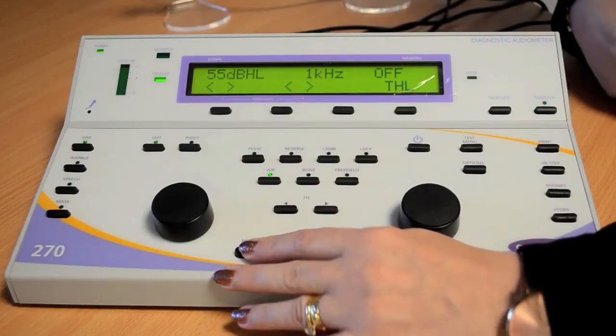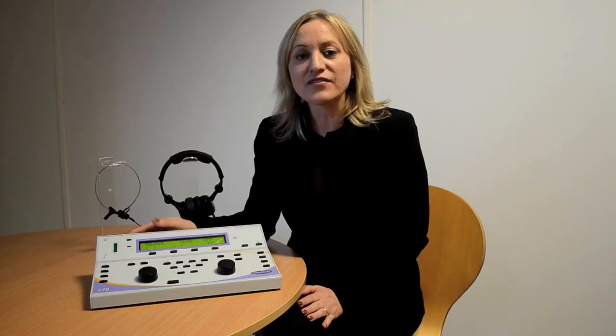To present the tone, press the present key. On the audiometer, you have the option to use a continuous tone. To use a continuous tone, press the reverse key. If you wish to interrupt the tone, press the presenter key.